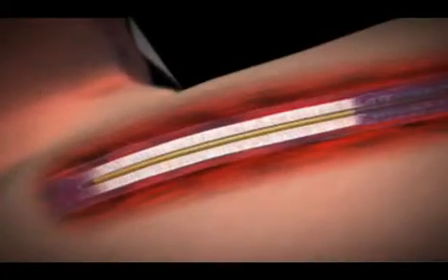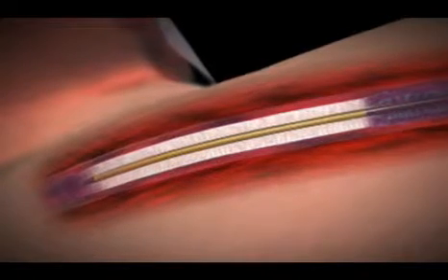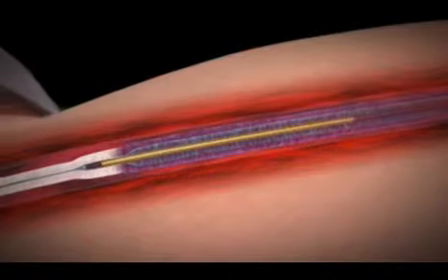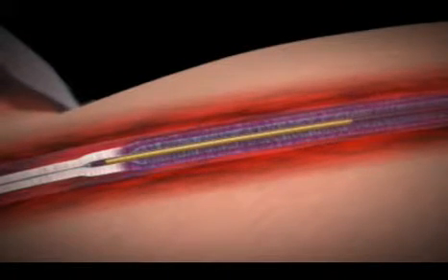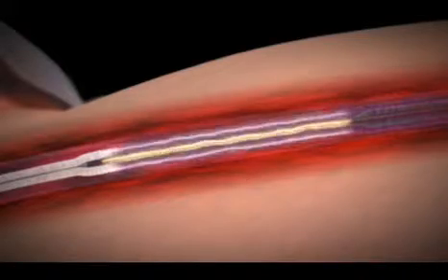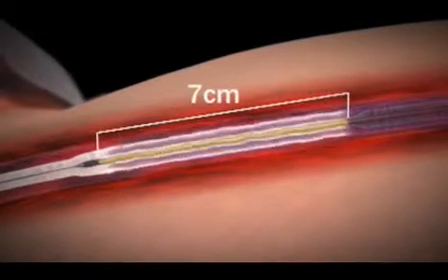Two of the newer techniques are called endovenous laser ablation and radiofrequency ablation. In that situation, a catheter is threaded through the abnormal veins and the vein is sealed shut by heating it from the inside out. You essentially accomplish the same goals as surgical stripping, but you don't have to strip the vein out — you just seal it shut from the inside.